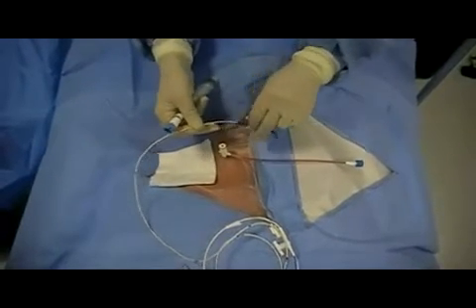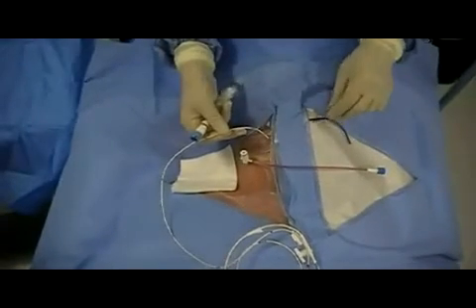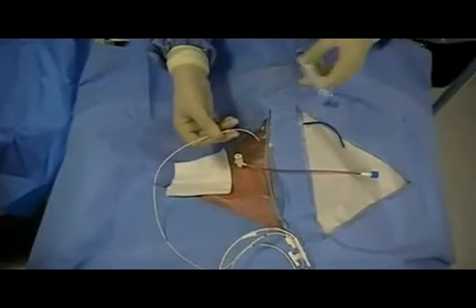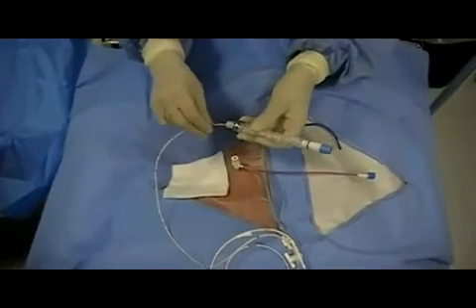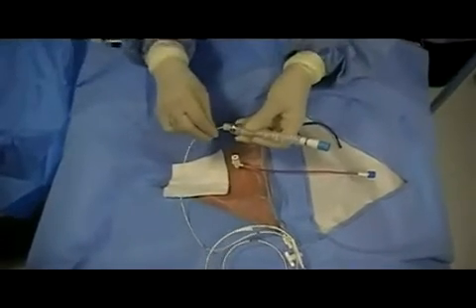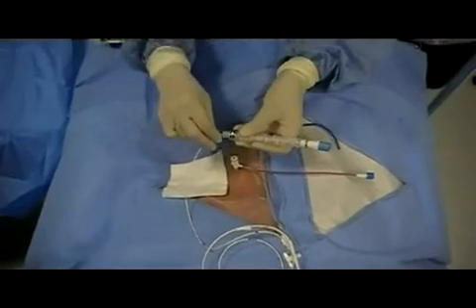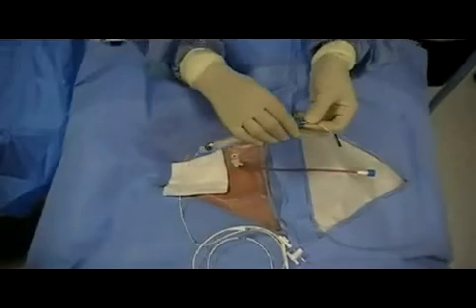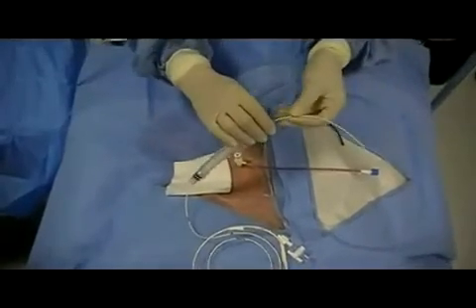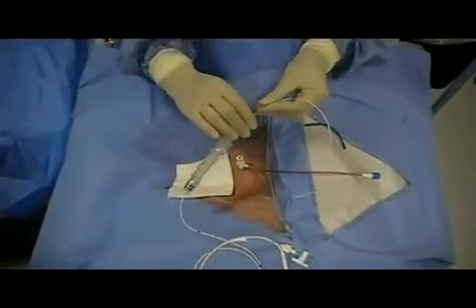Next, the contamination shield is placed. The contamination shield needs to be placed over the pacing wire prior to floating it into the patient. It can be placed out of the operator's way until the pacer is successfully placed, and should be left compressed until capture is achieved.